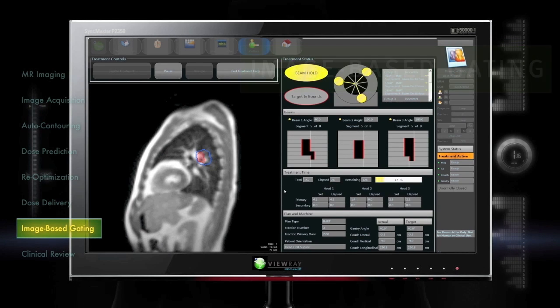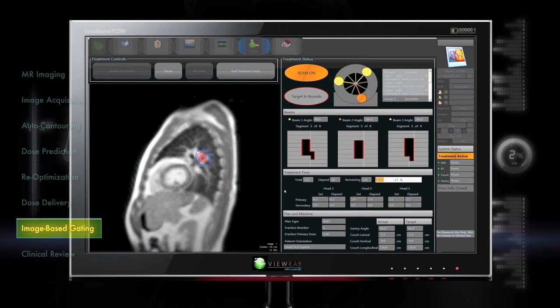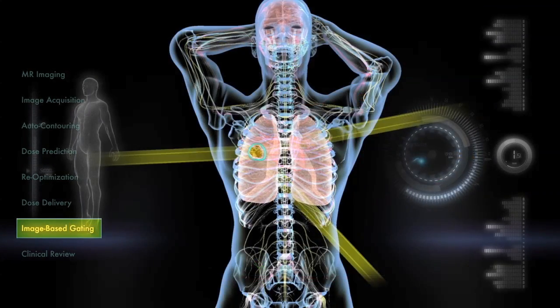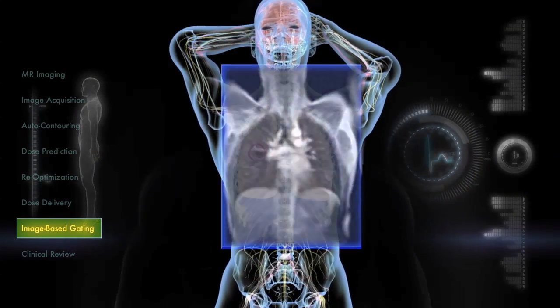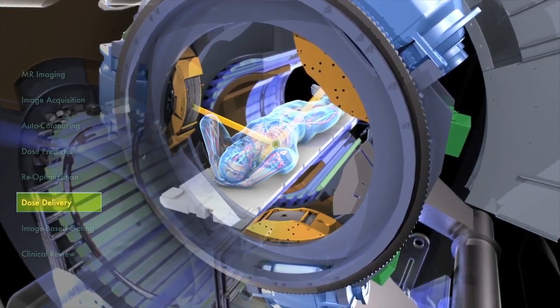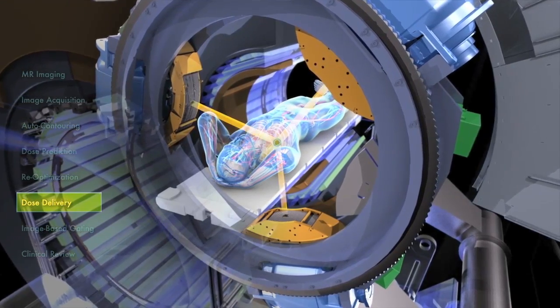Physicians can set acceptable limits on both distance and time for the gating parameters. Every time a sub-second image is captured, the system matches the image contours, checks the limits set by the physician and determines whether to continue or pause the treatment beam.